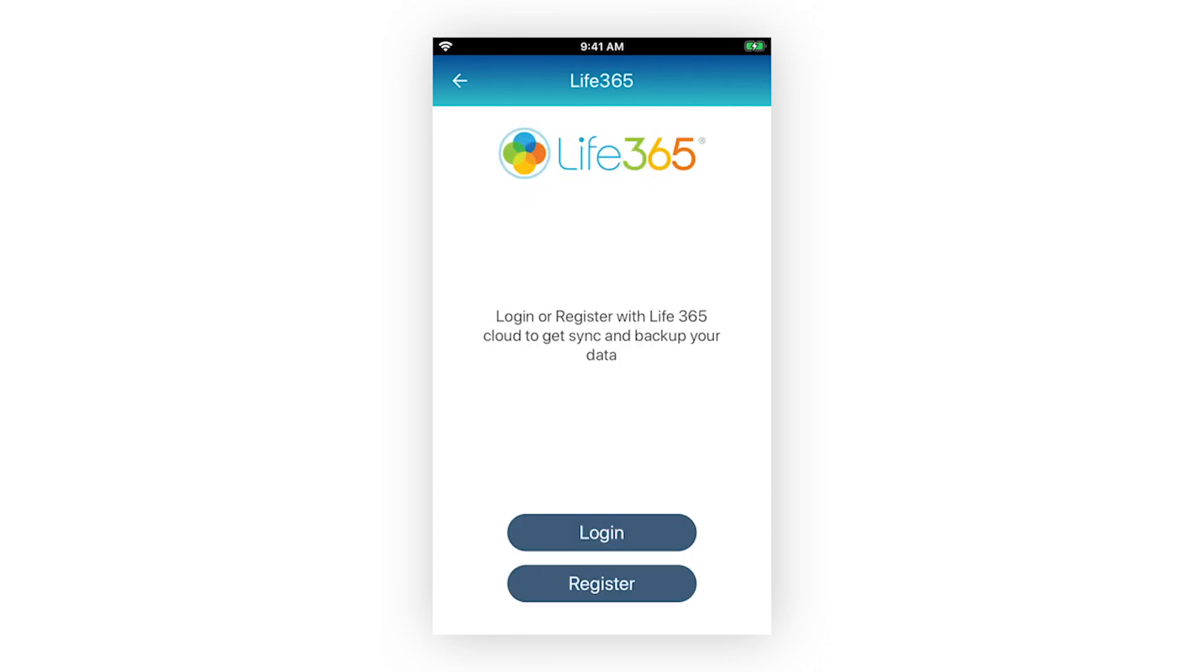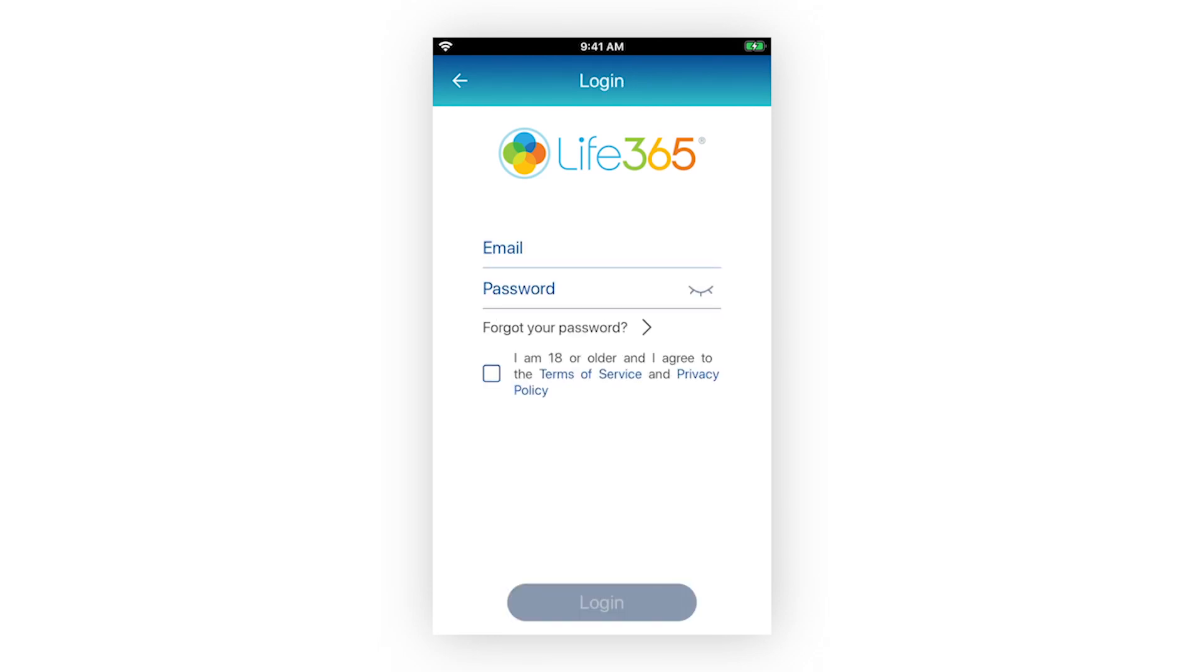On the Login and Register screen, select Login. Enter your email and password associated with your account, review Life365's Terms of Service and Privacy Policy, then check the box once reviewed. Select Login to proceed to your account.